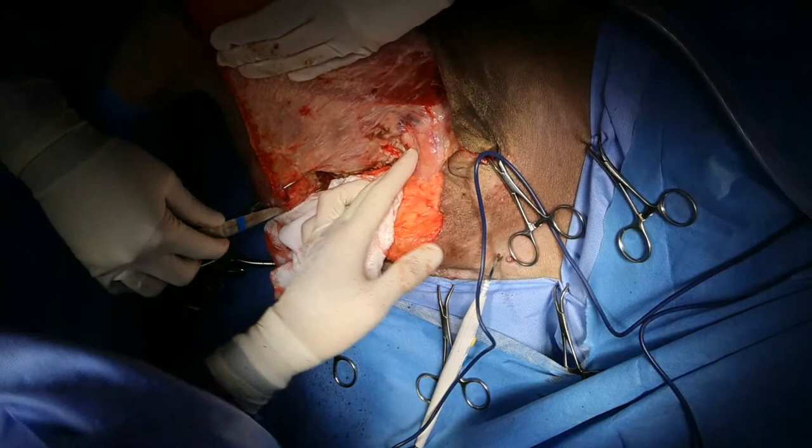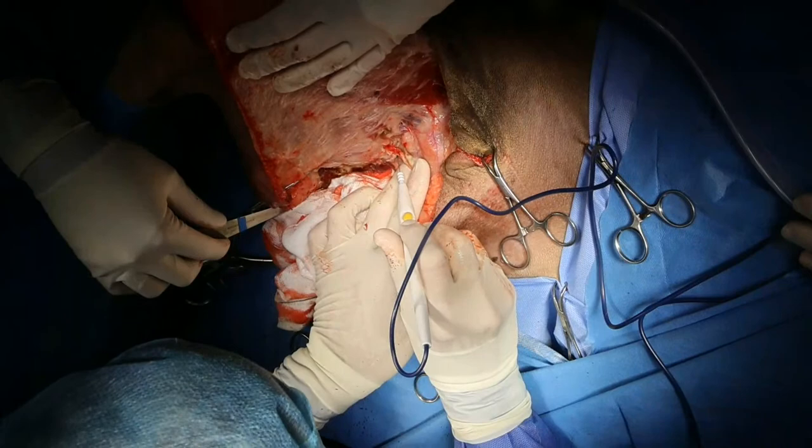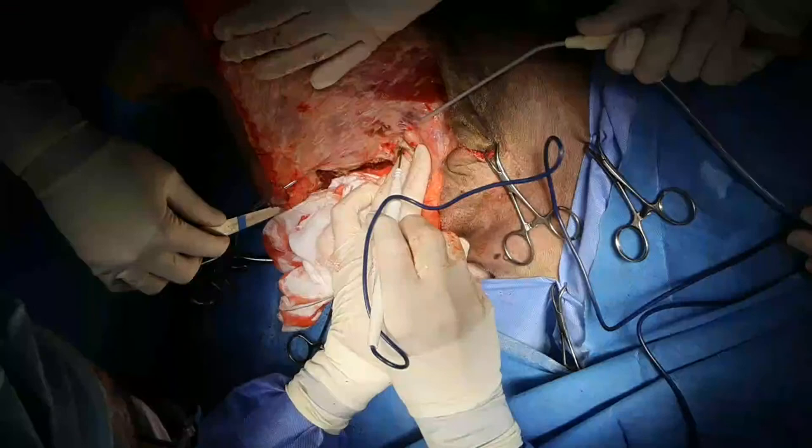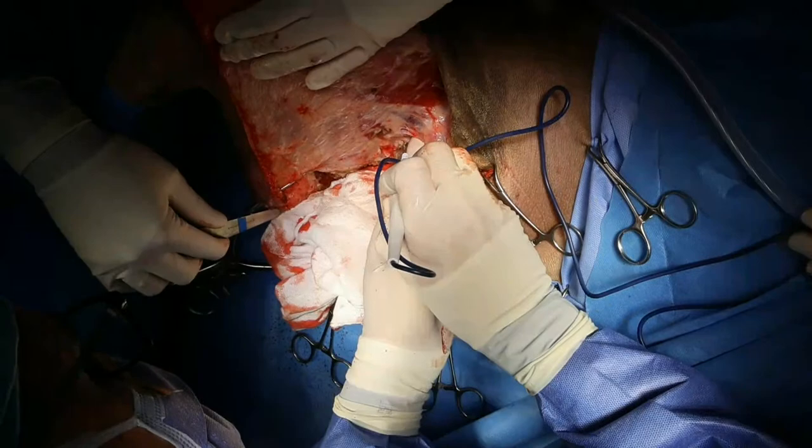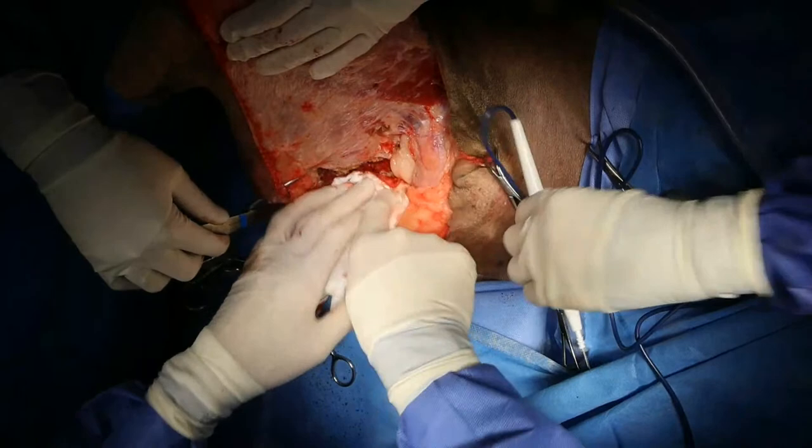And I'm going to be really careful as I come around because I'm going to encounter some really big blood vessels. Everybody knows my saying, which is don't cut anything you know the name of. And don't cut any vessels or any structure with less than 8 letters in the name.